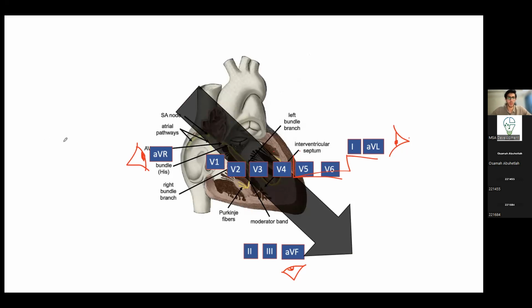So it depends on where they're attached to. So we know if it goes... Of course, it depends on where they're attached, right? And so this is why I simplified it all for you and gave you this diagram right here, right? At the end of the day, it all kind of trickles down to this diagram here. Regardless of where the AVR positive and negative electrodes are attached, in the end, it's going to look at the electrical activity from this vantage point, from this observation point.